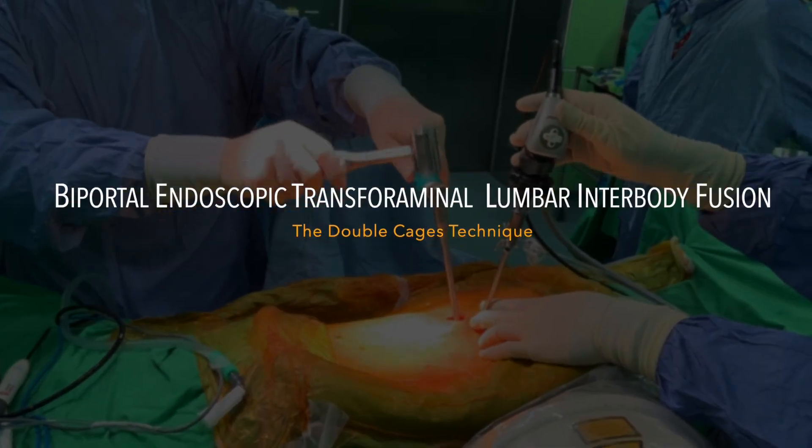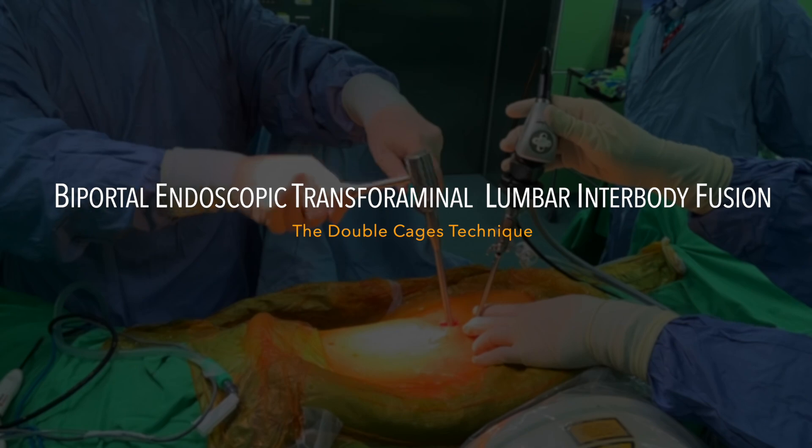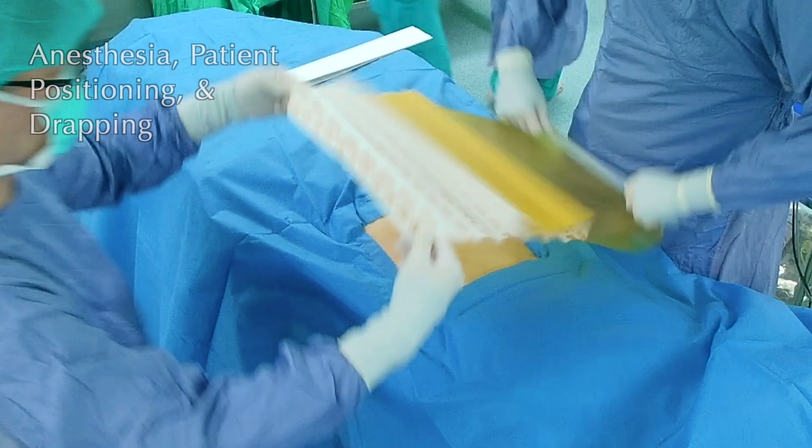This article will demonstrate Biportal Endoscopic Transforaminal Lumbar Interbody Fusion (BETLIF) surgical techniques using double cages.